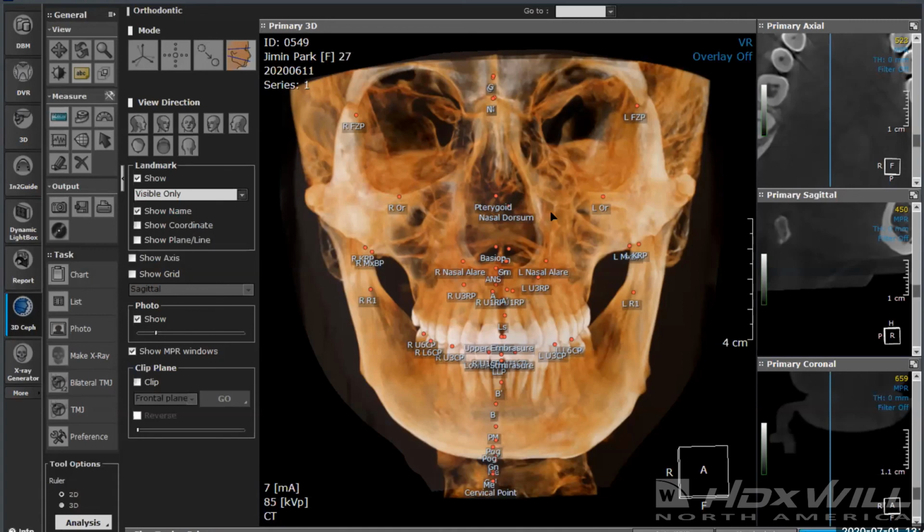As we start to progress, we're setting up to have CE credits given. We're going to have some doctors involved talking about actually analyzing CBCT images and ways in which you can do basic analysis of those images, and some different practices talking about how they use CBCT in their practice and their workflows, and how they've chosen to change from just doing two-dimensional images to integrating 3D images into almost every patient care item. So, things to look forward to, and some CEs as well.